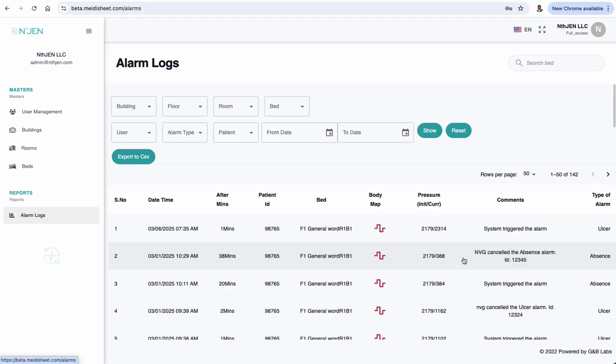Now, one thing that you did probably notice is the email address that we put in for the patient. What that is essentially, if the facility allows it, it's going to let the family get a link to the bed, and they would be able to see it.